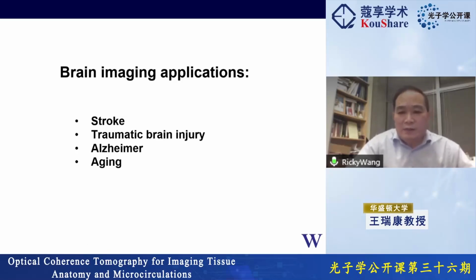Okay, for the small vessel disease, you need resolution of the system. And you can use the MR imaging, or you can even use the ultrasound imaging to look at the blood vessels.